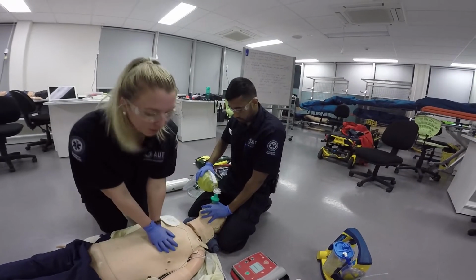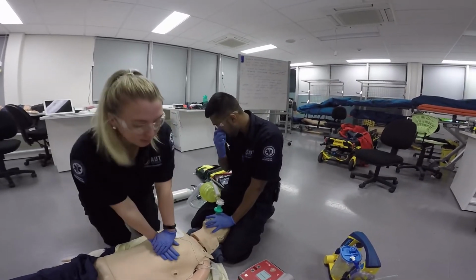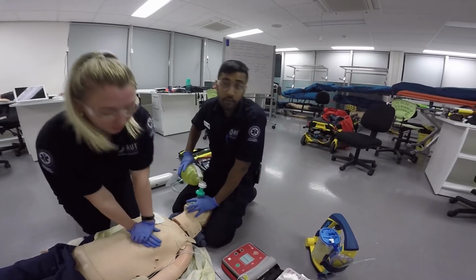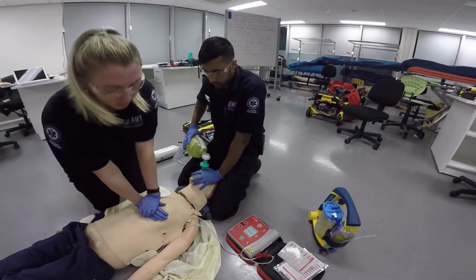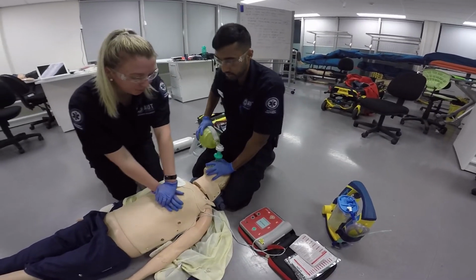25, 26, 27, 28, 29, 30. Chest rise and chest rise. Yep, good chest rise. Continue. Suction is also here if I need it, just right behind me. 25, 26, 27, 28, 29, 30. Alright, chest rise and chest rise. Yep, good chest rise.